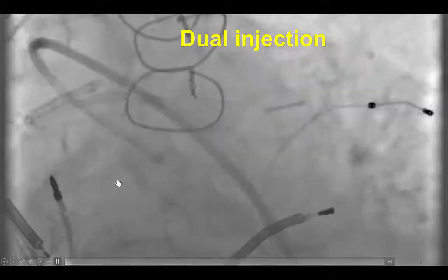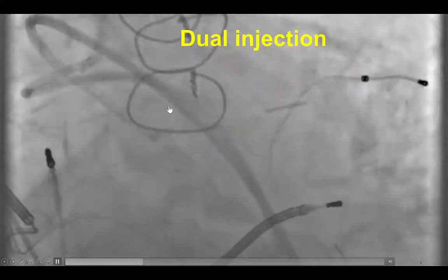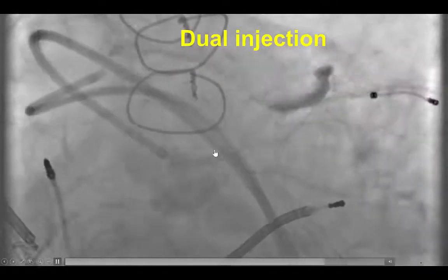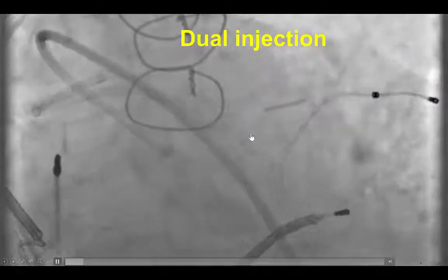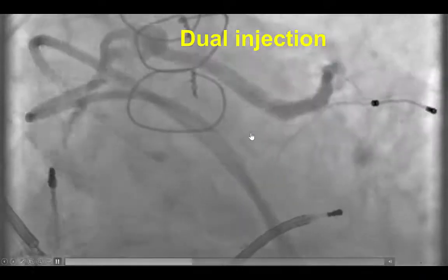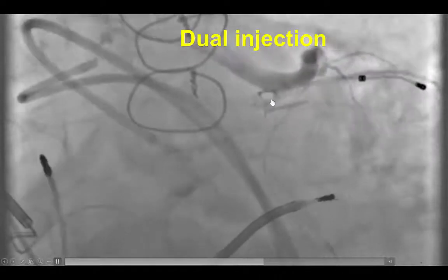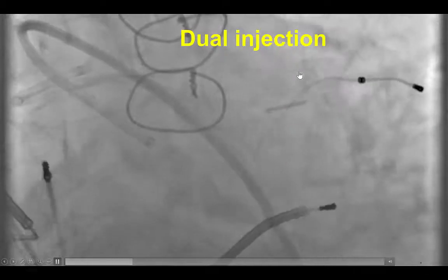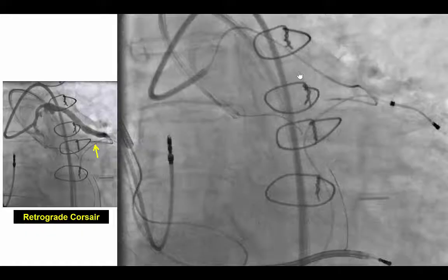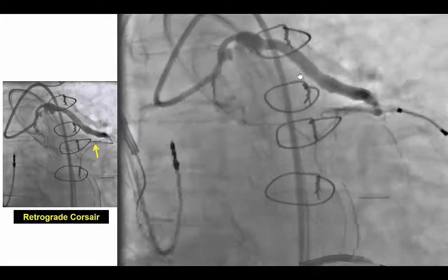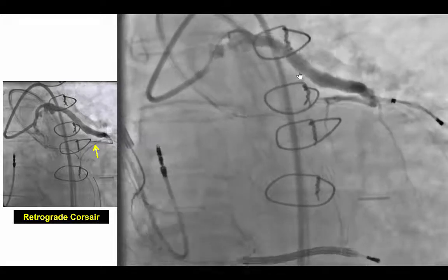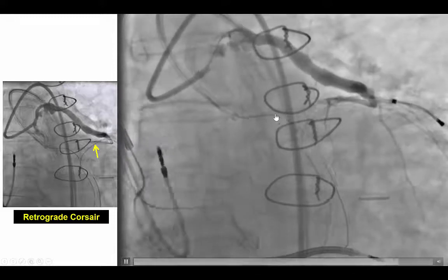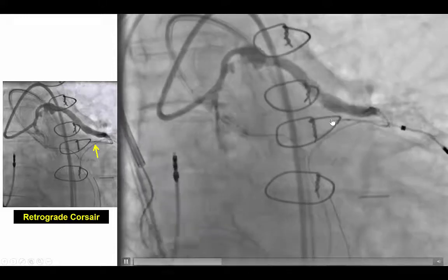We did a dual injection to determine the characteristics of the lesion. There was a proximal cap that was blunt. The length was hard to assess, but probably was in the range of 40 to 50 millimeters. The distal vessel was small, filling through the vein graft, and the vein graft itself was a nice collateral for retrograde access. In another view, there is a relatively lengthy occlusion between the ostium of the LAD and the mid part of the LAD.